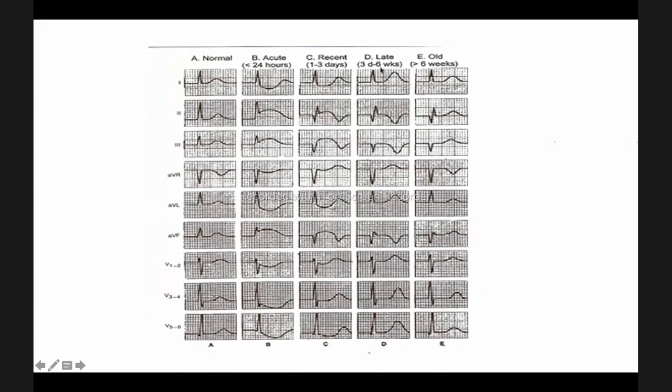Then late, up to 6 weeks, the ST elevation would have resolved, but there will be a Q wave showing that there was a myocardial injury there, and the T wave will be inverted. Then after 6 weeks, you might even find that the only thing that persists, if they had a scar, is the Q wave here. So this is the natural evolution of an ST elevation MI.